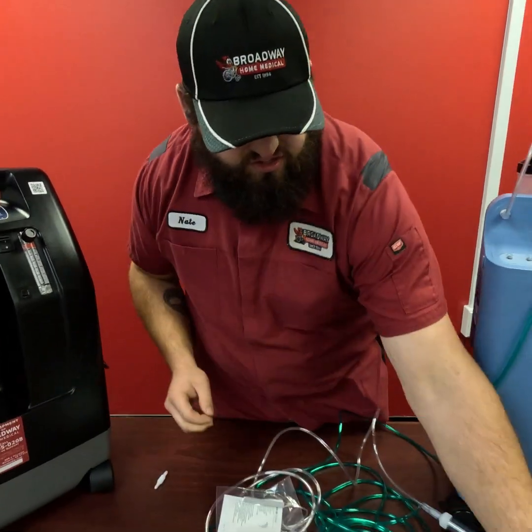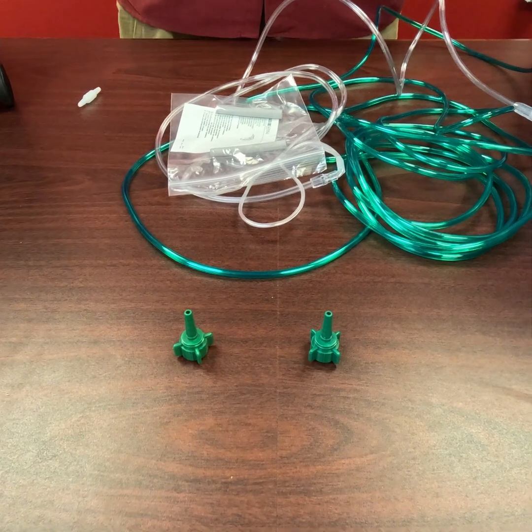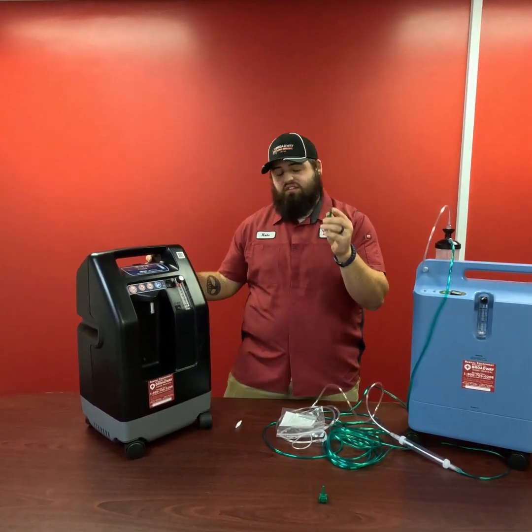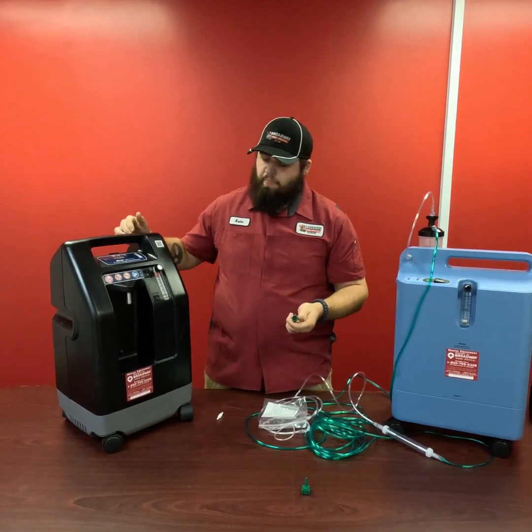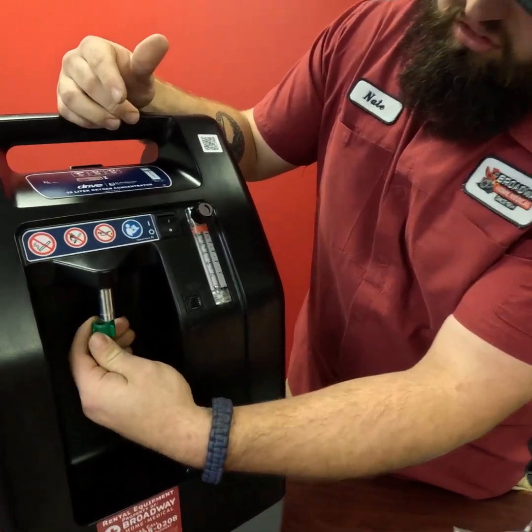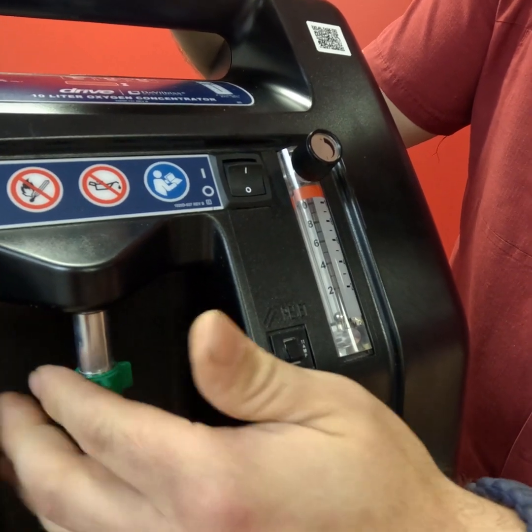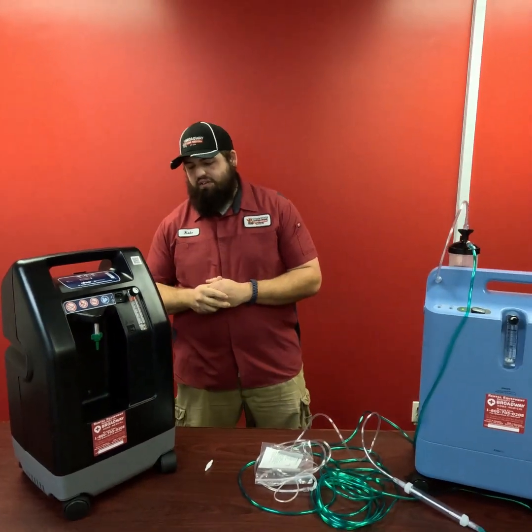So just like I had over here, I also brought in an extra one. Typically whenever we are setting up new oxygen and we're setting you up with a machine that does take one of these little connectors, I'll always like to try to deliver you an extra connector. That way if you were to lose this connector, you'll always have an extra one as well. But like I said before, these just thread onto the machine, and you do want to be extremely careful whenever you are threading onto the machine that you're not getting it cross-threaded. And I'm telling you, it's very, very easy to do. You just got to have a lot of patience when threading that on, and you'll be able to get that right on.